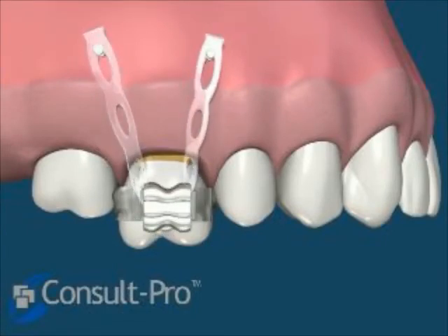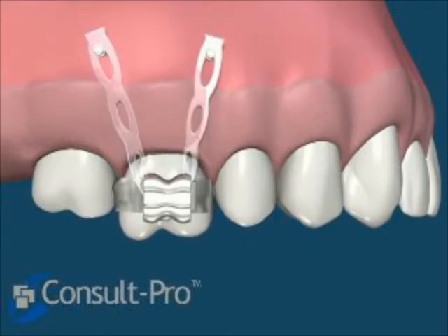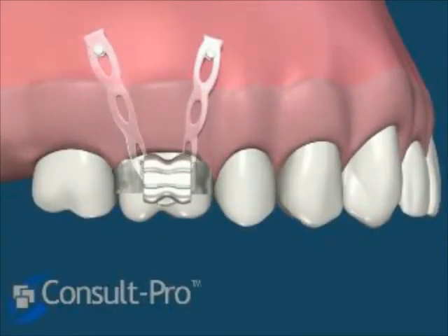Stretching this elastic band around the molar provides the apical force for intrusion of this molar. And this can be done both on the palatal and on the facial or buccal aspect to intrude this tooth over time and to maintain the proper torque and tip of this molar.